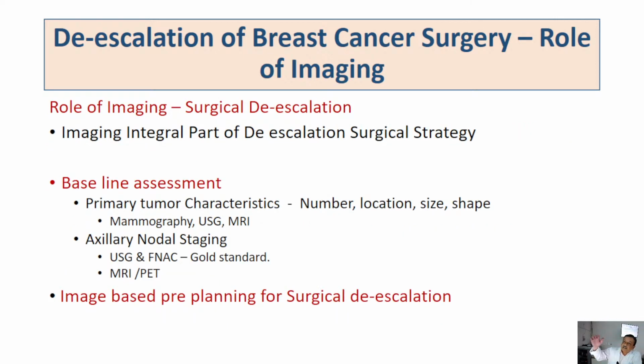In de-escalation, imaging plays a role for the surgeon: the information needed for the baseline assessment, the tumor characteristics, number of tumors, location, size, shape, everything. So we get that information. On an average, I keep recording.